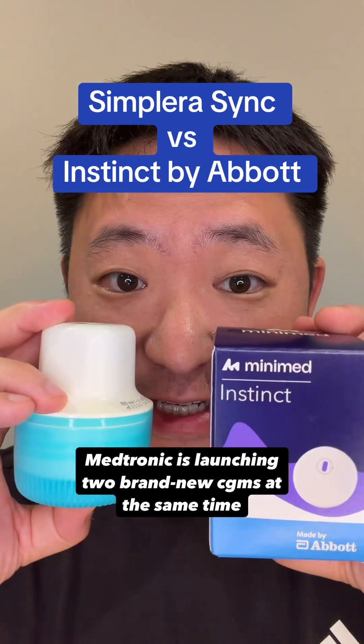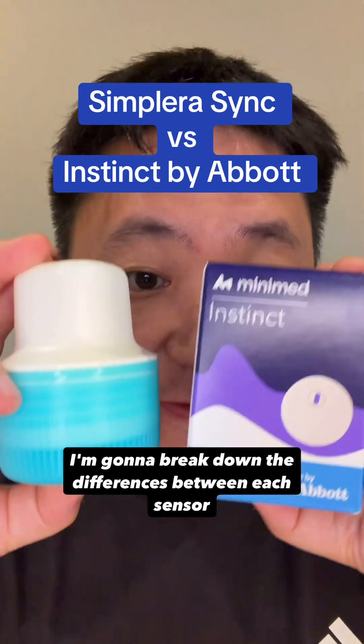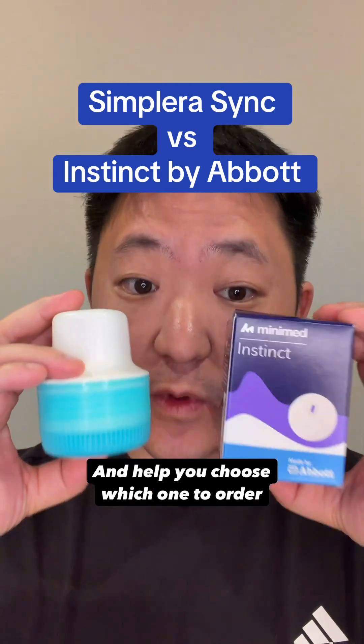Medtronic is launching two brand new CGMs at the same time. I'm going to break down the differences between each sensor and help you choose which one to order.